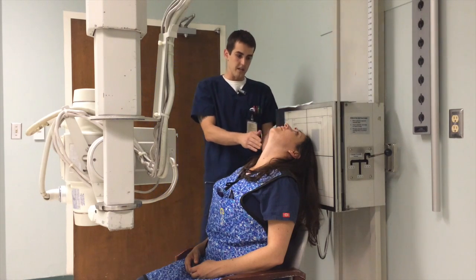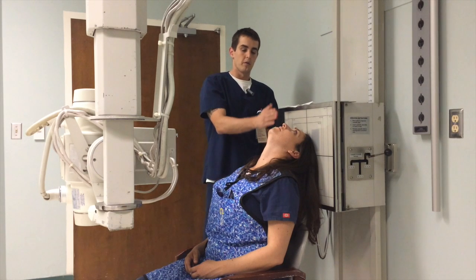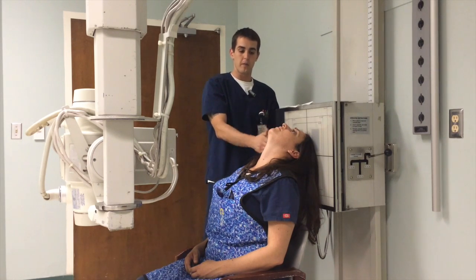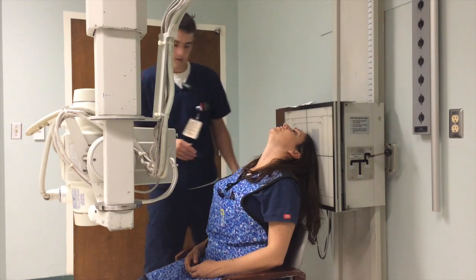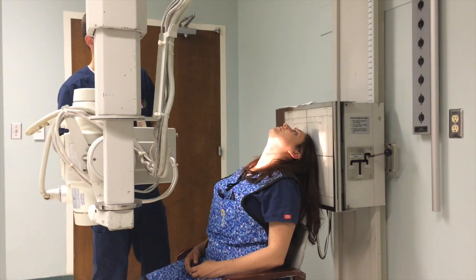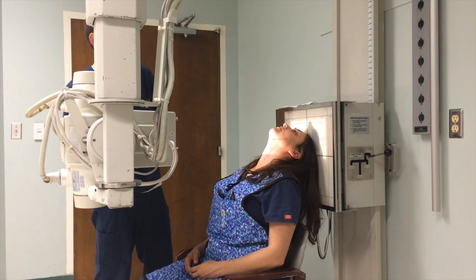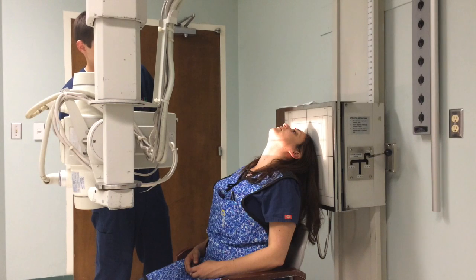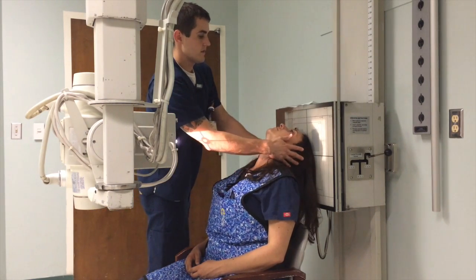And then we want the OML parallel with the IR, so they're on the same plane, which is what we have achieved. We want the central ray just 1 inch posterior to the outer canthus. Centering more.